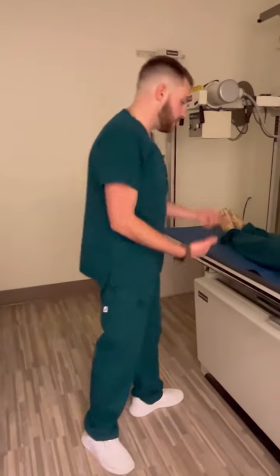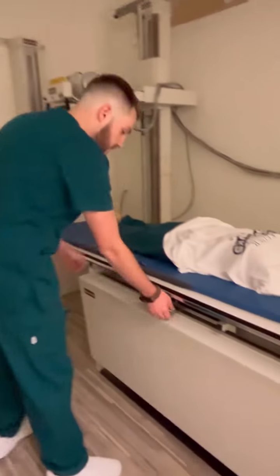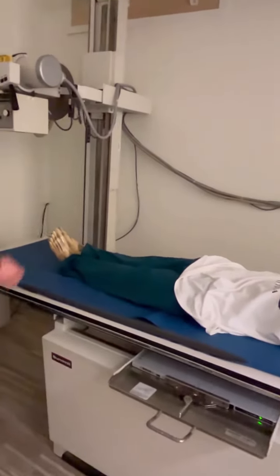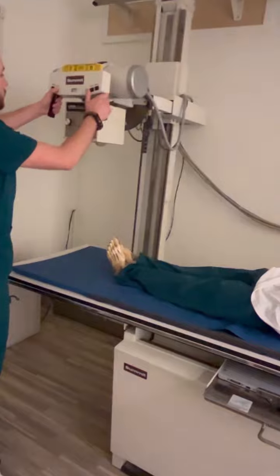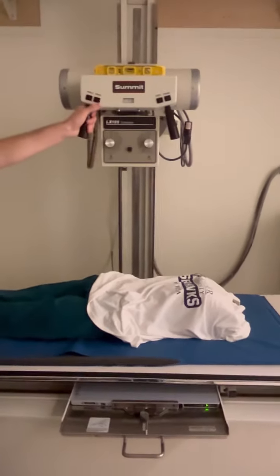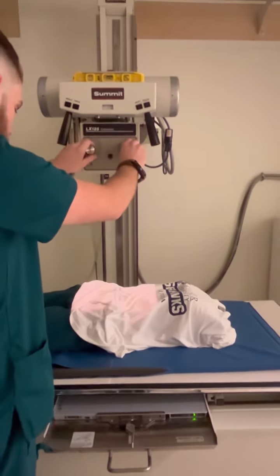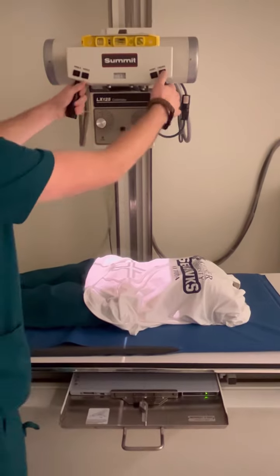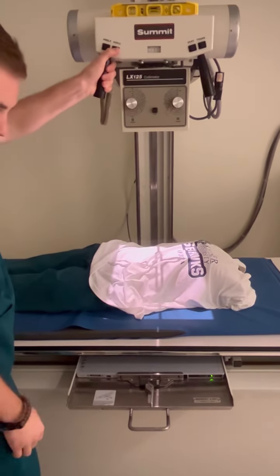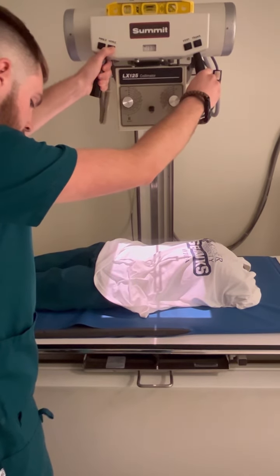So now that I have my patient on the table, I'm going to start lining everything up for this exam. So first things first, we're going to line up our tube to our IR. And we're going to be at 40 inches SID to the table bucket. I'm just going to bring this out just a little bit to make sure I'm aligned. And that's about centered right there.